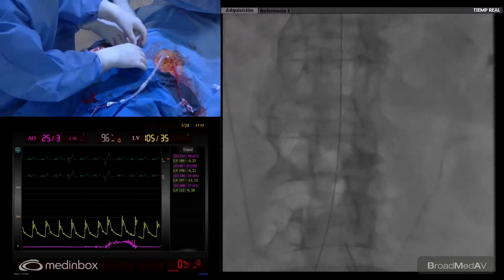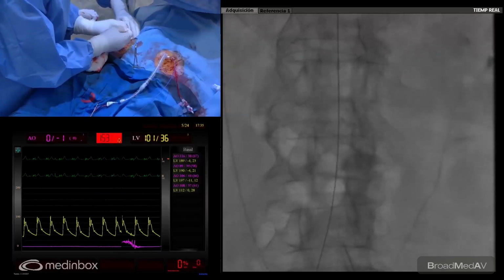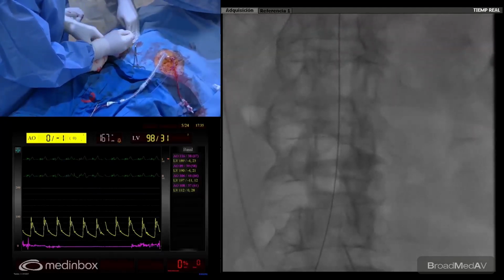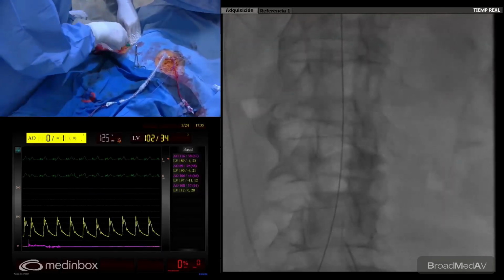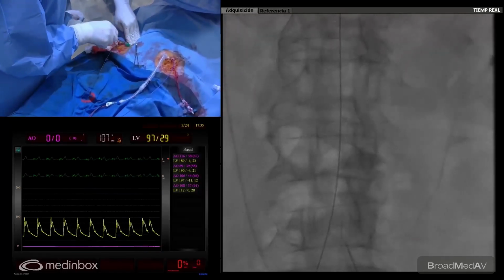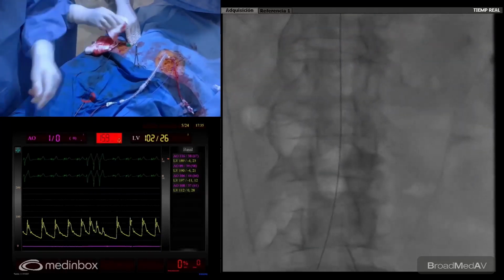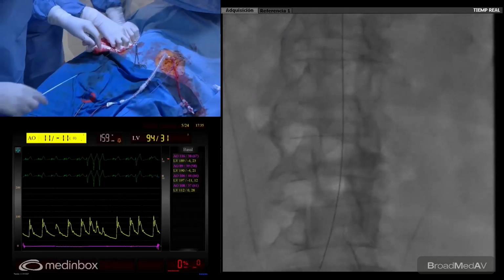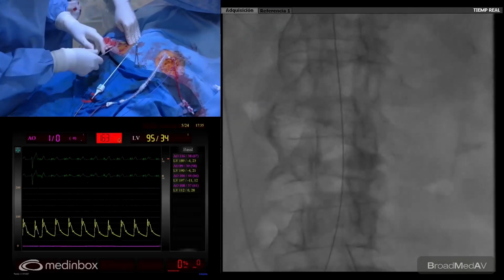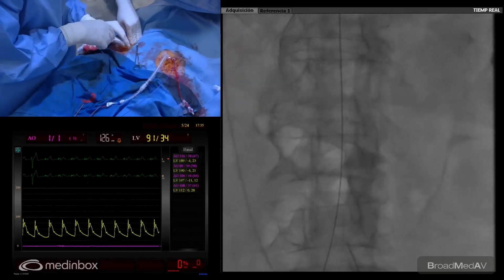Well, you know, the suture was broken, probably because of the depth. We are now using only one. With only one, we are almost okay. But for sure, we had to use the angioseal. Give me the angioseal 8. It's so deep. It is impossible to reach the artery. So probably we also have to exchange. Give me, Carlos, the balloon. Give me a 9mm or 8mm balloon. So we are going contralateral, and we inflate the balloon there, and then we hold the groin for minutes.